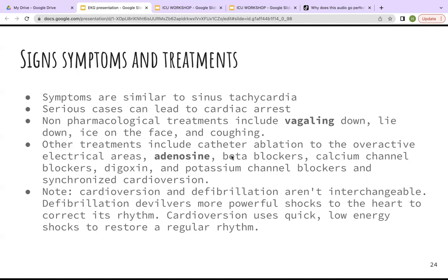If your patient isn't awake, you're able to go straight into cardioverting. It is an option on the ZOL as well as the defibrillator. But if you have an alert patient that needs cardioversion, if it's not emergent, it would be in the patient's best interest if you recommend to the physician some sort of sedation, because it does hurt and it's scary.